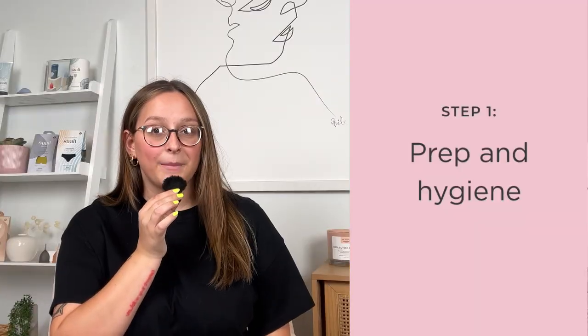Step 1, prep and hygiene. Before touching or inserting your cup, wash your hands using warm water and a mild soap. Then, you're going to want to sanitize. Before your first use and between every period cycle, boil your cup in water for 4 to 5 minutes. Let it cool completely before inserting.